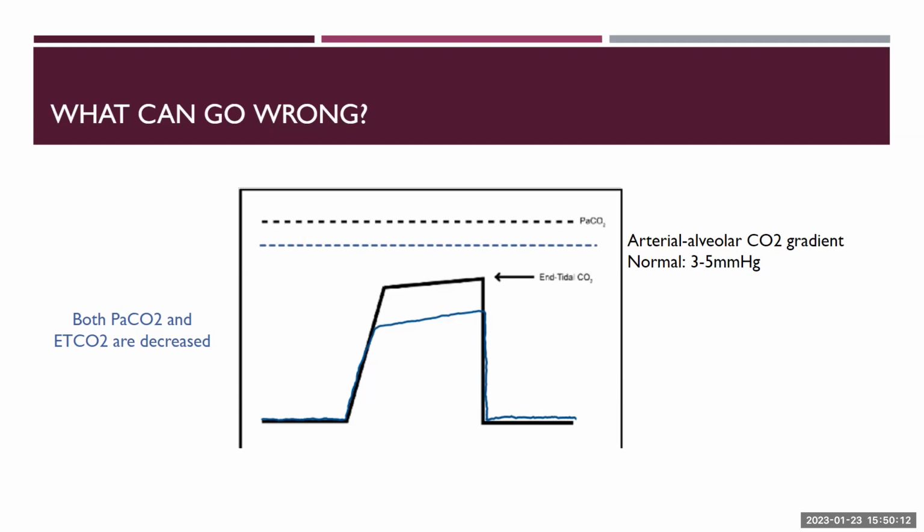I was also thinking about hyperventilation. I was just trying to think about how they could both be low. I mean, if an air trapping process is causing them both to be high, then I'm not really sure what could cause them both to be low unless like, or just diffusing really easily.